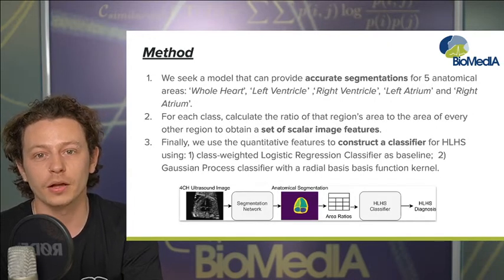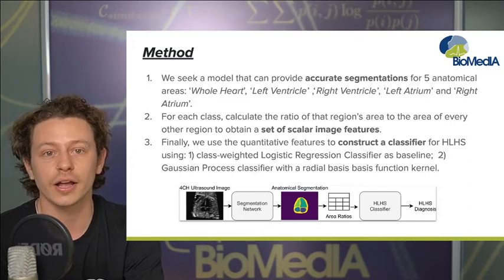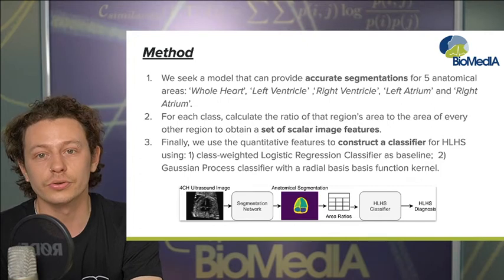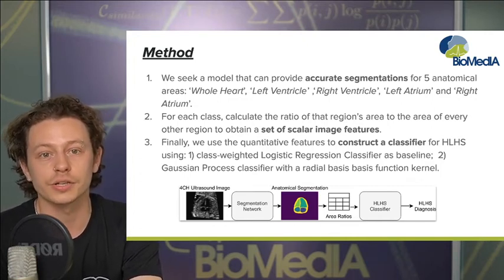So in this paper, we introduce a novel method for the diagnosis of HLHS from ultrasound images using pathology-robust segmentation. We assess the quality of our segmentations in the downstream task of inferring HLHS status from ventricular areas. From ground truth expert annotations, we evaluate the possible correlation of this approximation to true disease status, known from postnatal outcome records, and compare this correlation to using naive segmentation for area extraction to our proposed method.